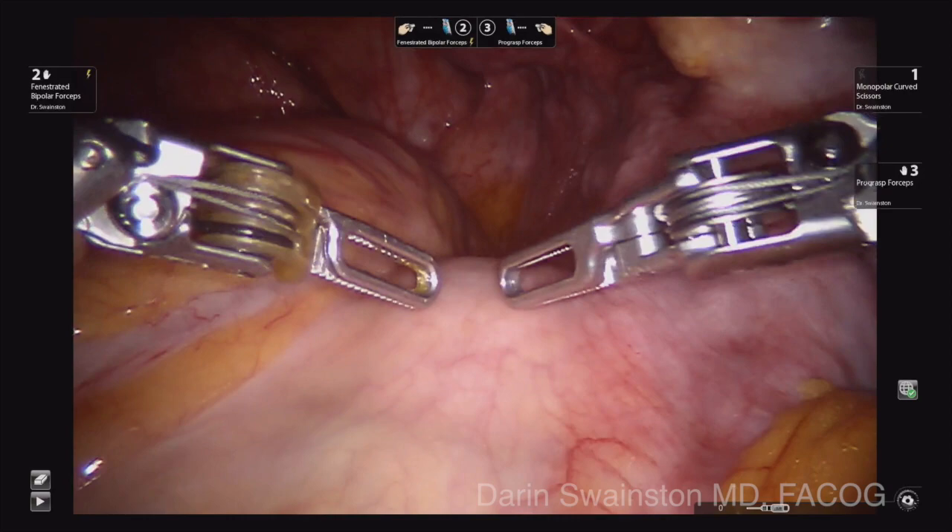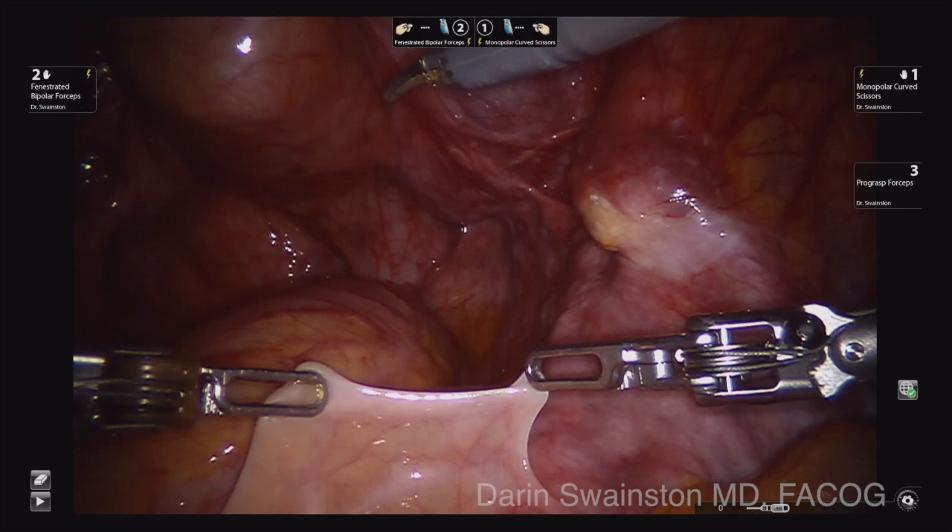It is a good idea in general to visualize where the ureter is, as you see here, and then to go medial enough to be away from the vessels as you dissect down the pelvis.